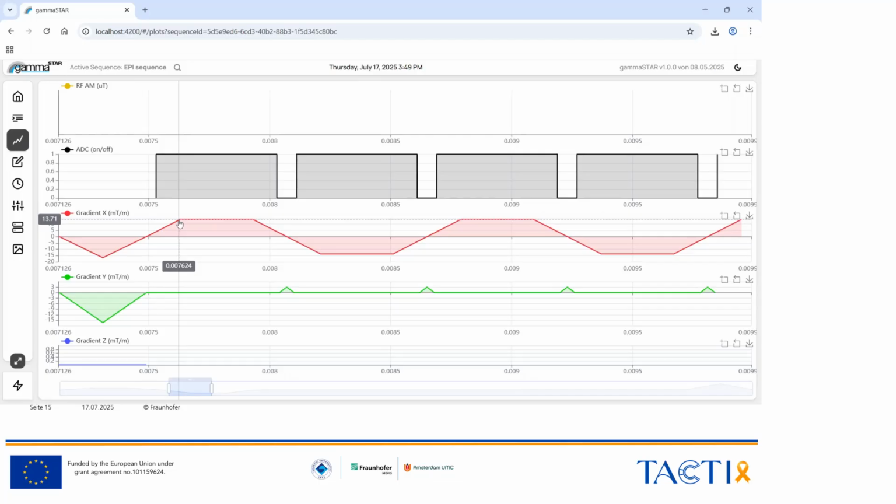And that's exactly what Jörn has to consider during the reconstruction. I don't know, you probably do a regridding of these samples, so putting it back on the regular Cartesian grid, even though they are not acquired in equidistant samples. And for that, he needs to know exactly where these samples are acquired in k-space. And we deliver this information to the reconstruction server, so it can just shift the position of these samples.